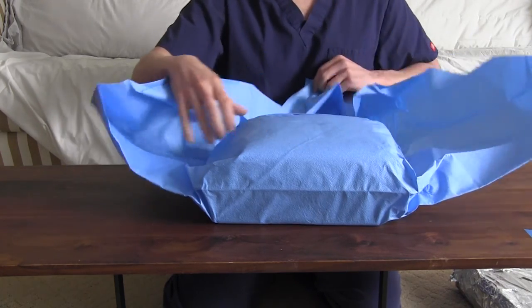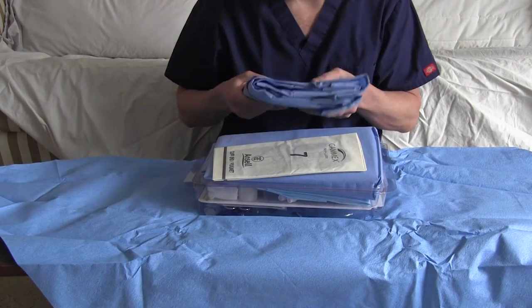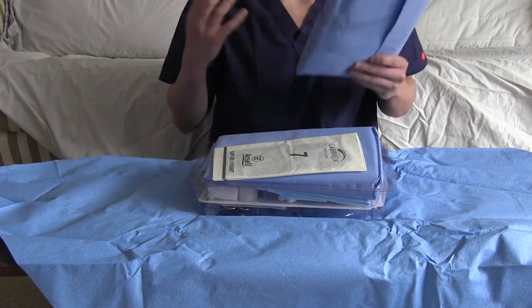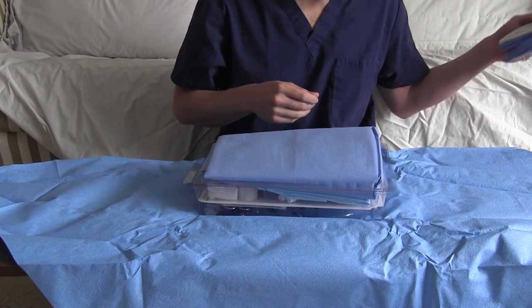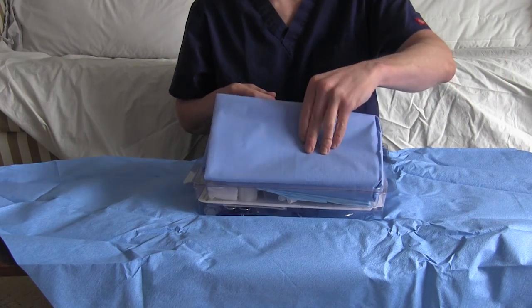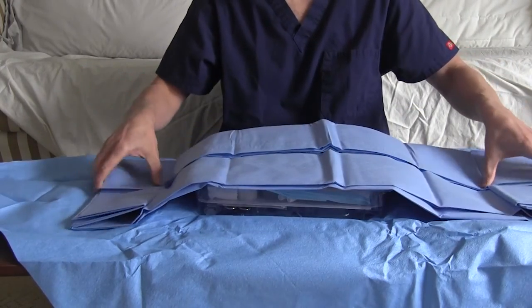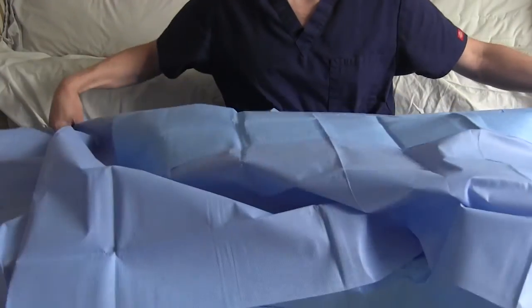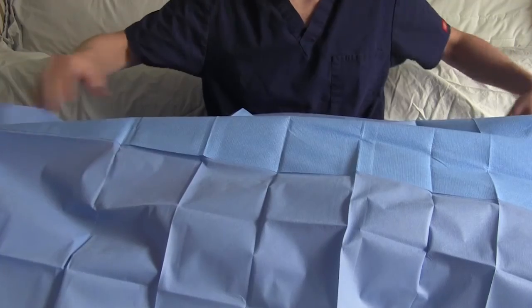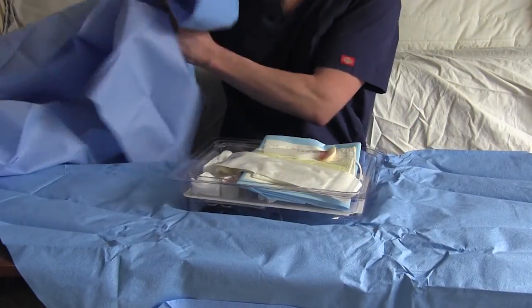All right, let's open up the sterile portion. All right, here is your gown. This is a full gowned hat, mask, sterile glove procedure. You have another set of sterile gloves in here, so you get full sterile. I'm not going to do that for the purpose of this video. You have a very nice drape, which, while not full body, is covering up all of the surfaces you care about for this procedure. And this is a non-fenestrated drape. So what you're going to do is use this to cover up everything except the actual site.